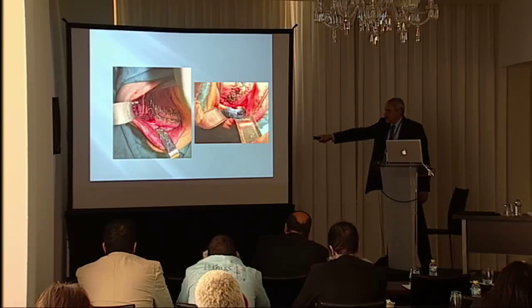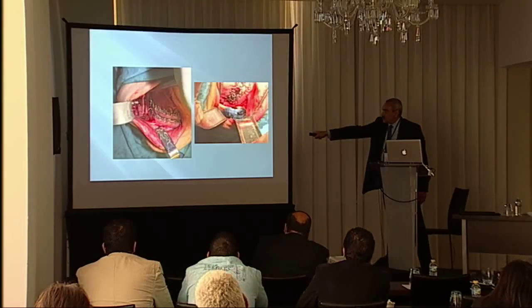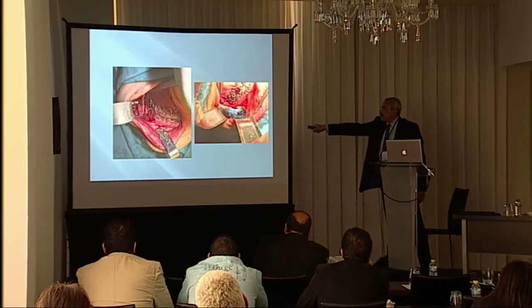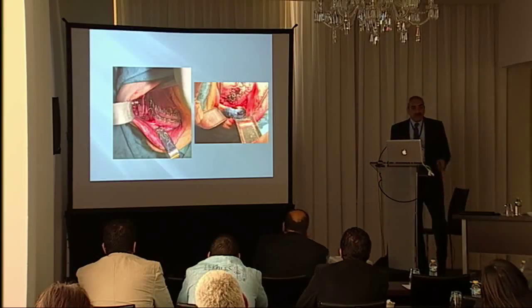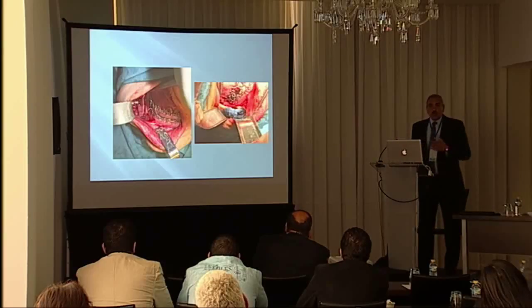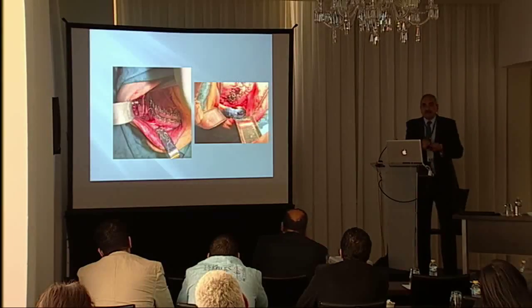We can see this blue line. This one is transparent. I don't know if you can see it or not, but actually, especially in setbacks, I found a gap in between the segments. When we try to position the condyle, we use what we call the transbuccal trocar, which we use to drill through and place the screws, and we put the bone segments together and press them on each other so they contact each other.